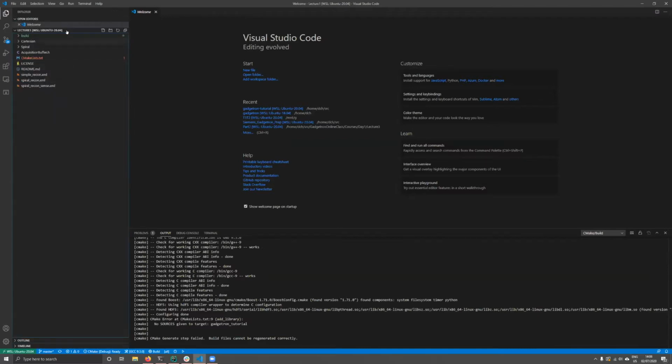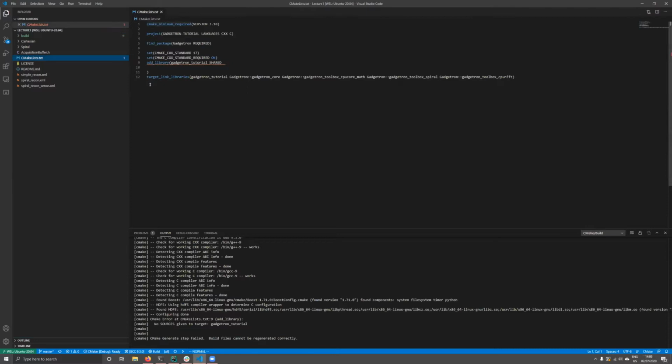If we look at the directory, you can see there's a CMake list. This is intended as a good starting point for writing your own gadgets or your own toolboxes. But this is not actually inside Gadgetron. This is using Gadgetron as an external library. So you can see we have a project here called Gadgetron Tutorial. We start out by finding Gadgetron. We set the C standard to 17 because otherwise things won't compile. And we add a library, and it's complaining because we have no source files. So let's fix that.